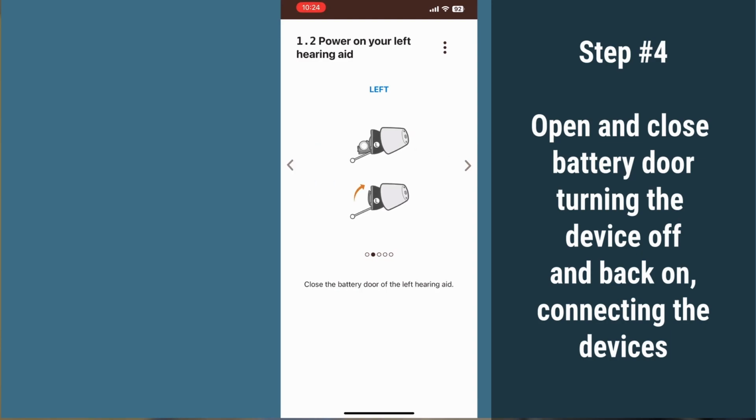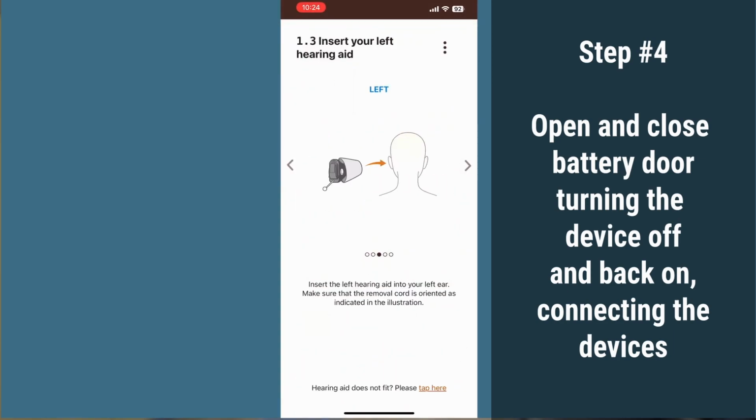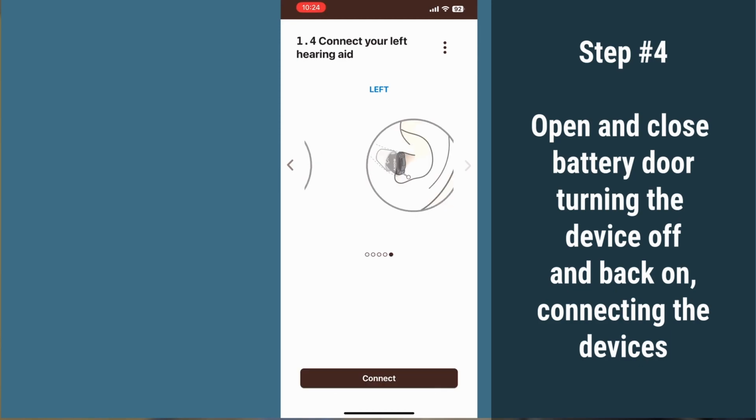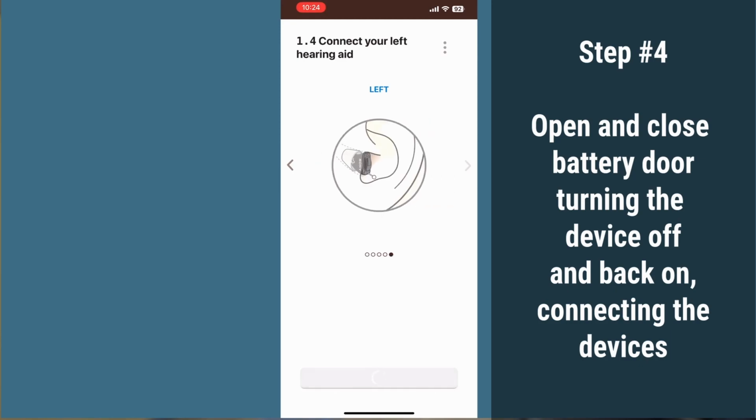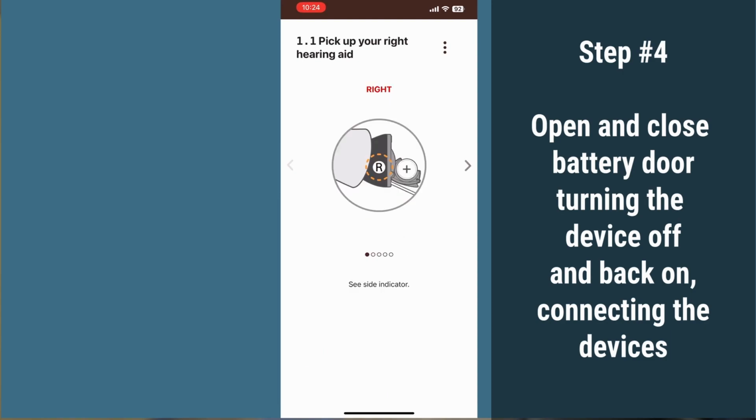And then it's going to have you put the hearing aids in. Obviously, we're starting with the left ear. So once the hearing aid is in the left ear and connects to the app, you're going to hear an audible tone. And once you hear that tone, you have to select whether you heard it or not. Okay, it looks like that left one is paired. Now we're going to do the same thing with the right ear.